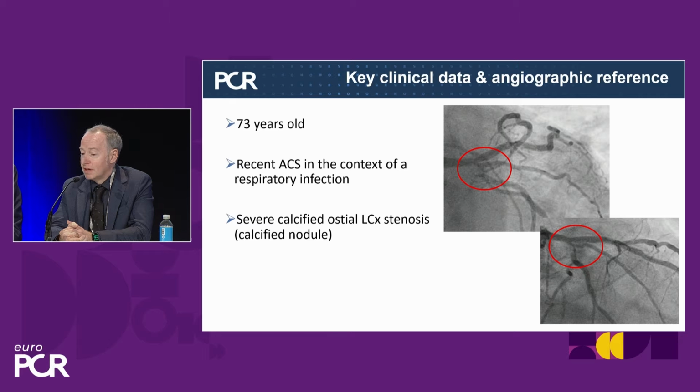Allow me to do something I'm not used to do, that is to involve our colleagues in a time-by-time fashion, also to disturb them while they're eating. Do you agree to use imaging to start with, or would you start this procedure just on the basis of the information you have? So I will pose the question again by show of hands. Who's happy only with angiography and can go on with this procedural plan? Raise hands. Who needs imaging to go on? And when we speak about imaging, who would like to do intravascular ultrasound? Raise hands.